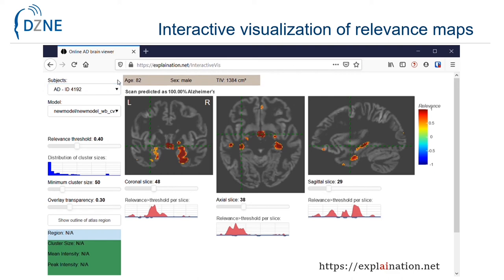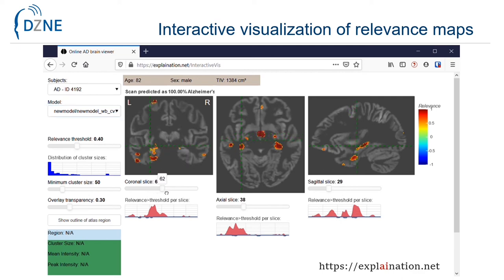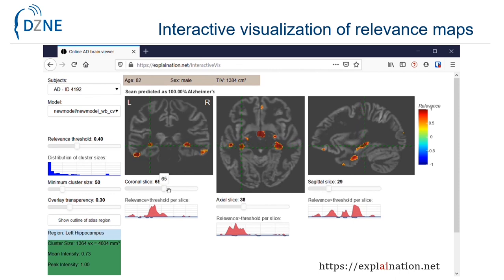One can select the subject and one of the 20 CNN models, adjust various visualization parameters if required, and freely navigate through the slices to inspect the relevance maps overlaid on the subject-normalized gray matter maps.